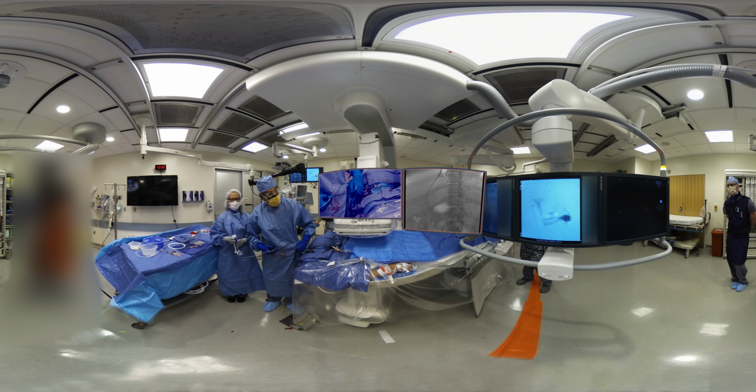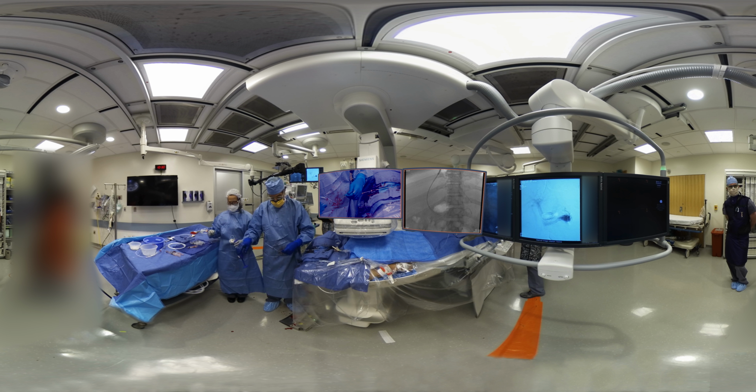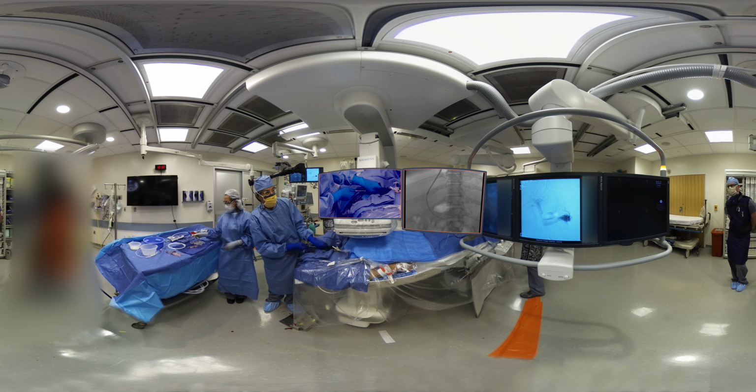So I'm going to advance the balloon back in. I'm going to secure the wire, and we can disconnect the tubing. Thank you. And then over the balloon, I'm going to try to advance the sheath in some combination. And there's rule number 2.